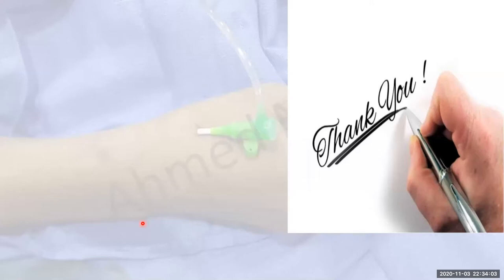Okay, this is actually a much-discussed issue, and I think this is the most accepted theory for that. Again, the patient presented with STEMI in the ramus territory and the thrombus propagated retrograde. Because of the tight lesion in the distal left main, which we approximately calculated to be around 80% or more, the thrombus propagated retrograde and blocked the left main. This is our explanation. I don't know if he has any other explanation.